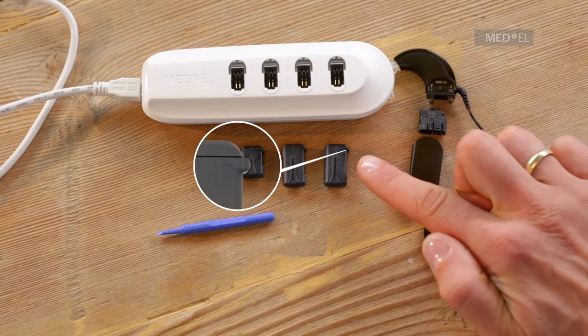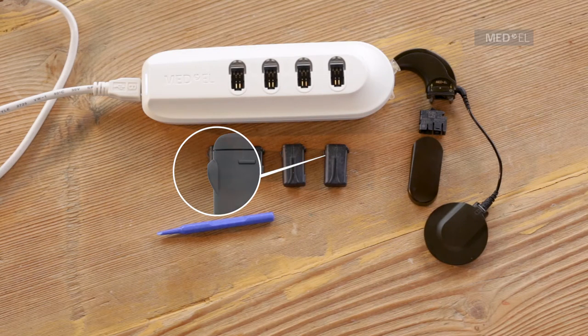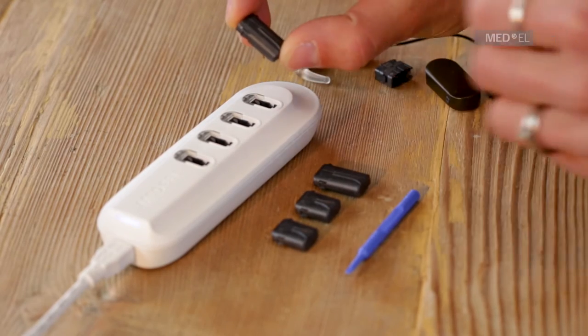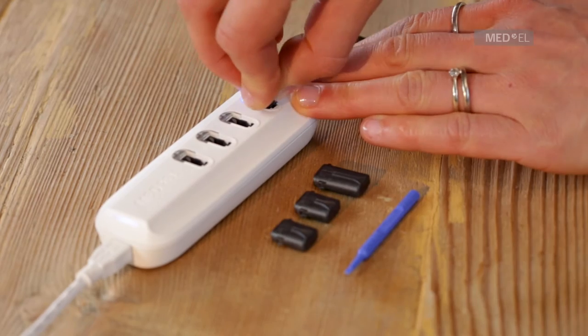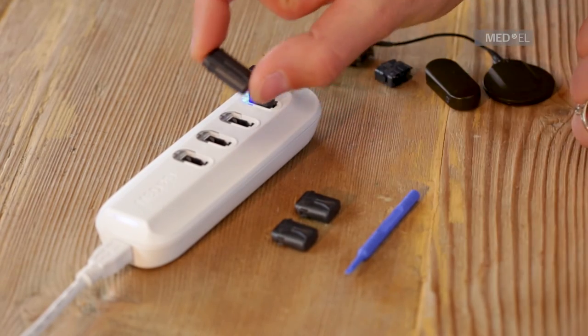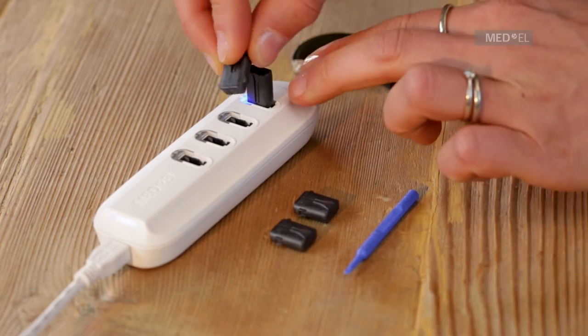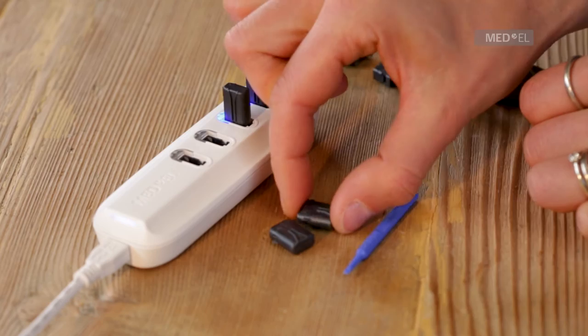The battery has a lip on one of the narrow sides and a ridge on the other narrow side. To insert the battery into the charger, hold the battery at a slight angle and insert the lip under the transparent side of the charging slot. Then tip the battery towards the white side of the charging slot until the ridge snaps into place.